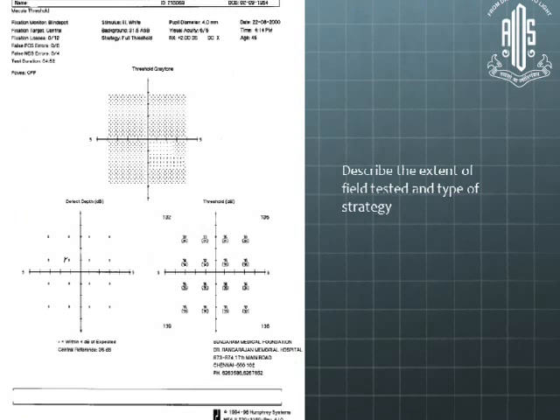go ahead and do what is called a 5-degree field or the macular field and so on. Not every glaucoma patient would need this, but advanced glaucomas threatening the central 5 degrees, central 10 degrees, you need to do these kinds of fields.